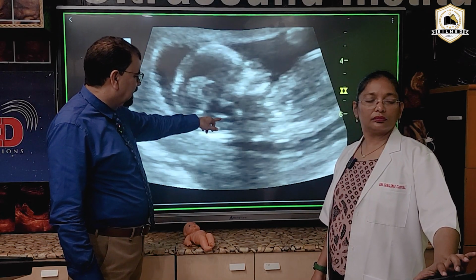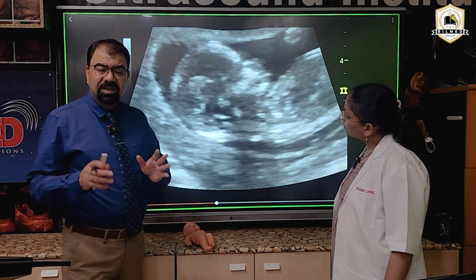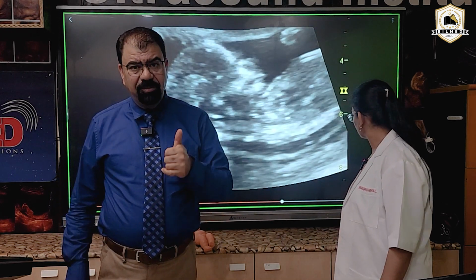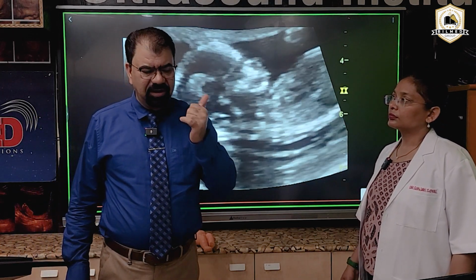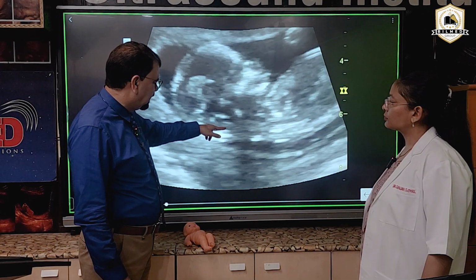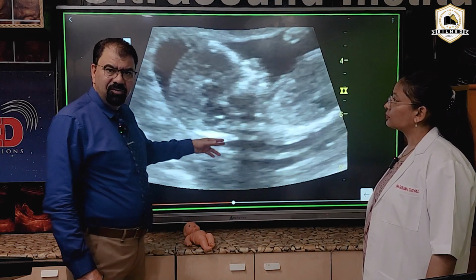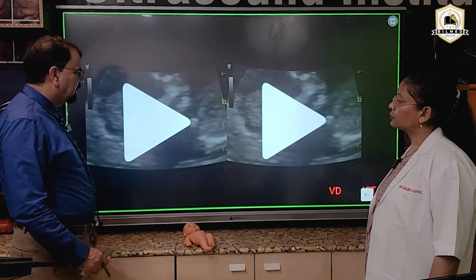So this is the ICT. This is the intracranial translucency over here. The section again is the mid-sagittal section. I told you that the complete mid-sagittal section is the backbone. Without a complete mid-sagittal section, you will neither see a nasal bone, nor the NT, nor this ICT. The intracranial translucency will be seen just over here, near the cisterna magna. We will discuss this in detail.